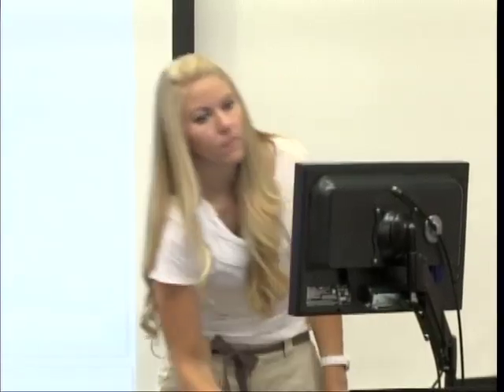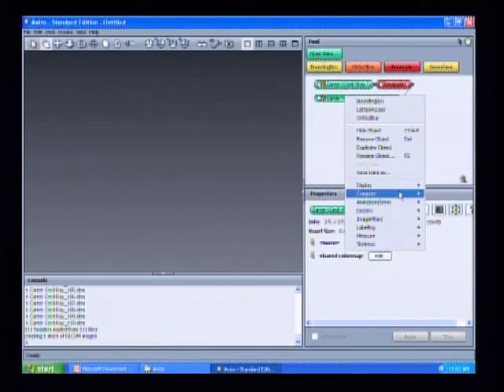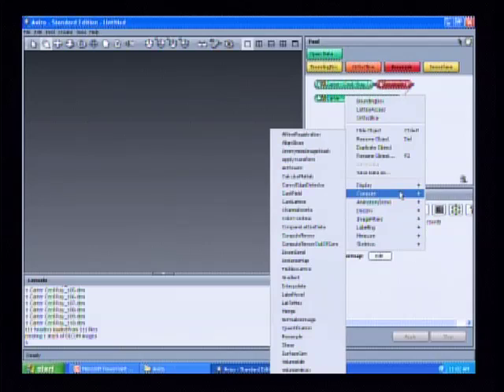Okay, great. So this particular data set doesn't have any dental implants, and we did that for simplicity reasons. This person, I believe, doesn't have any teeth, so it's beneficial. But the next step that we normally would do is we would right-click on our data set again. We want to go down to Compute, and then we want to select Cast Field from the Compute option.